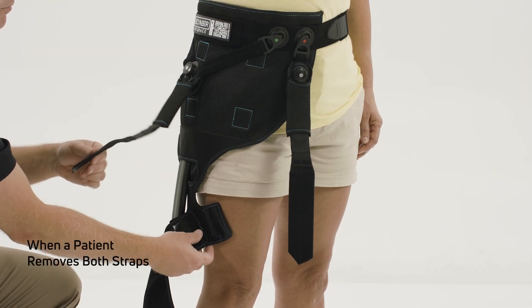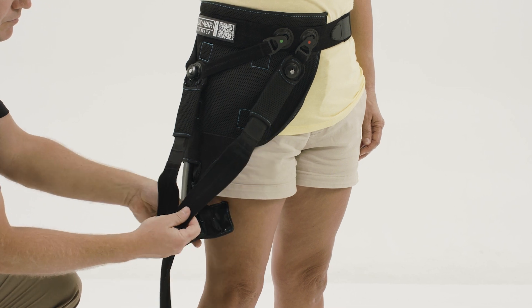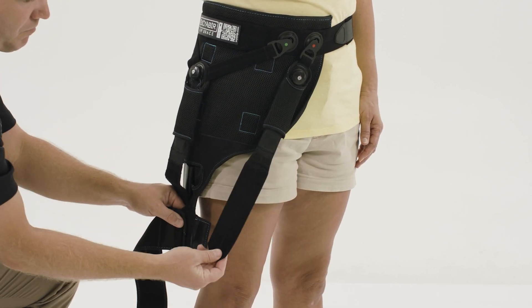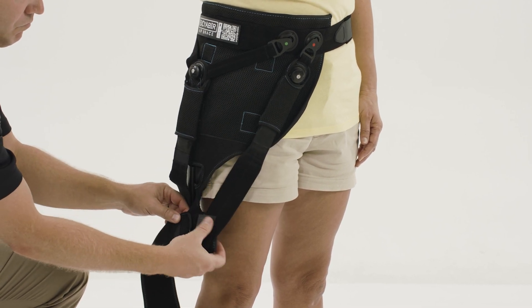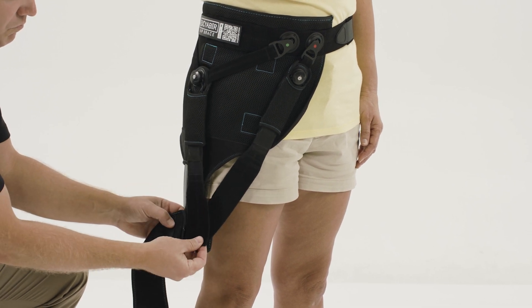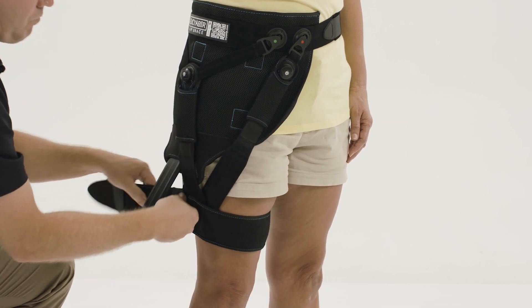If a patient has accidentally removed both the abduction Y-strap and the rotation strap, follow this procedure. Unwrap the T-strap. Apply the rotation strap to the front of the T-strap. Locate the velcro strap in the accessories pack, place it on top, then place the Y-strap on top of the velcro holder and wrap the T-strap forward.